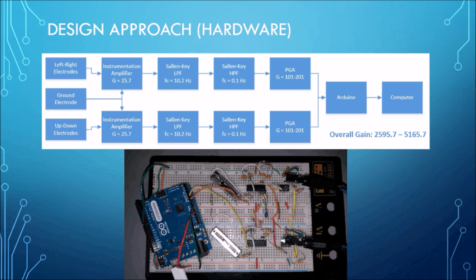Here's an overall block diagram of our hardware as well as a picture of the circuit on the breadboard. At first, the 2 electrode pairs are amplified by instrumentation amplifiers. Then they pass through second order Sallen-Key low pass and high pass filters. And lastly, we use a programmable gain amplifier, or a PGA, to adjust the gain of the final circuit. These 2 signals are then read by the ADC on our Arduino Leonardo, which interfaces with the computer. The overall gain of the circuit varies between 2500 and 5100 in order to accommodate almost all eye movements.